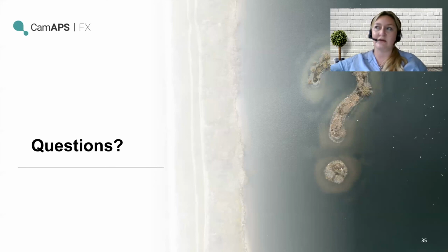And I think we saw that, Annika, didn't we? We didn't really know what the right thing to do was in terms of Annika's eyes and using the system, and we started with 11. We set it at 11, and I spoke to a couple of the consultants in clinic, and they said, why don't you just go down half a millimole on the target every two to three weeks, depending on how it goes. So it took us quite a few months to get down to a normal target level with Annika.